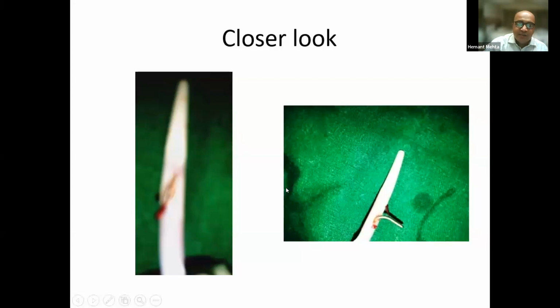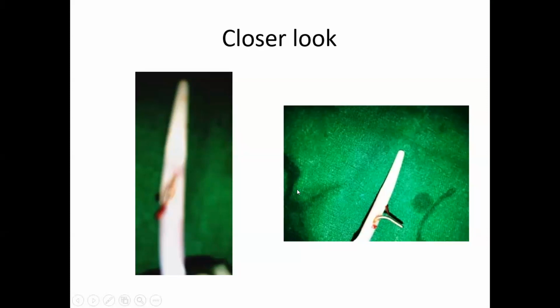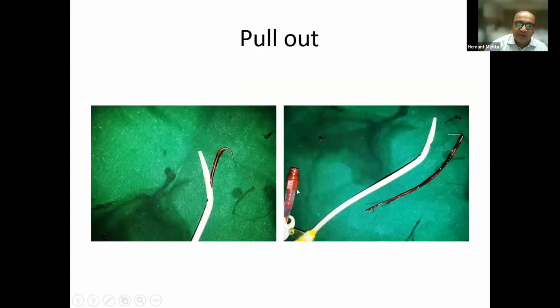So now you understand. Where it had broken here, the catheter had got like a kink, and then it got doubled up on its own body proximally. That's why we are seeing the blunt tip. So then more pull out, and this is how it was. This part was broken. Now, when this happened, luckily the dustbin had not been cleared.